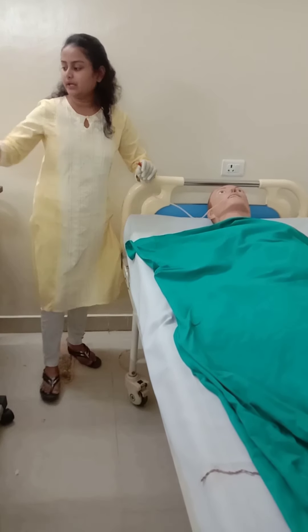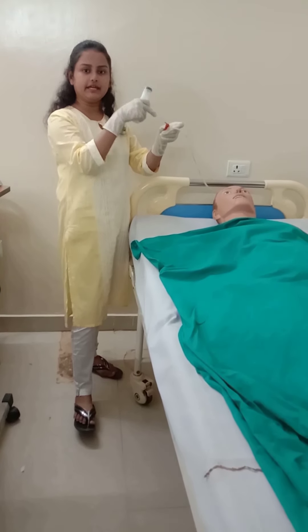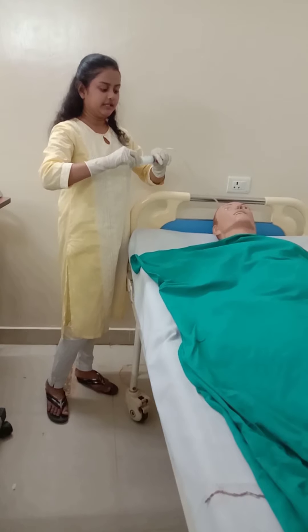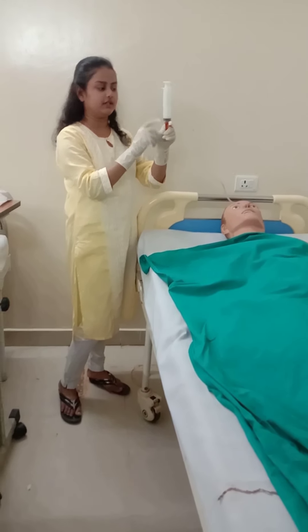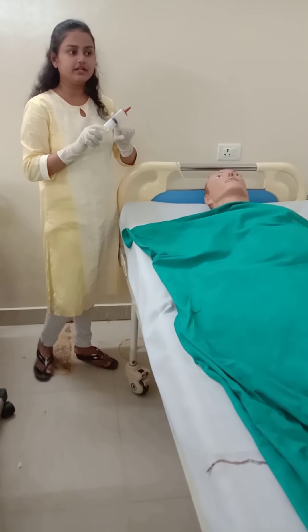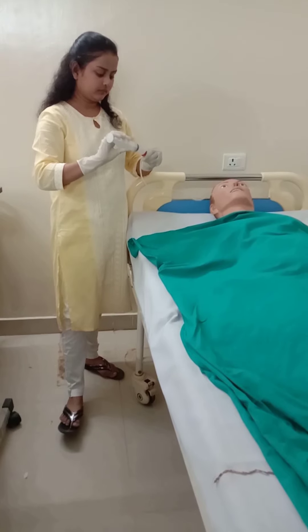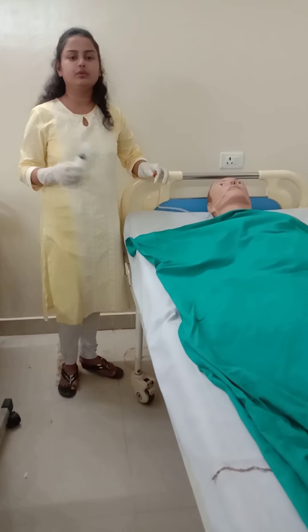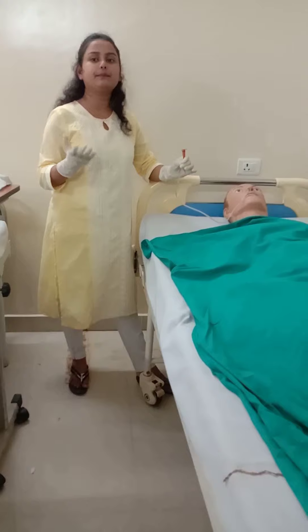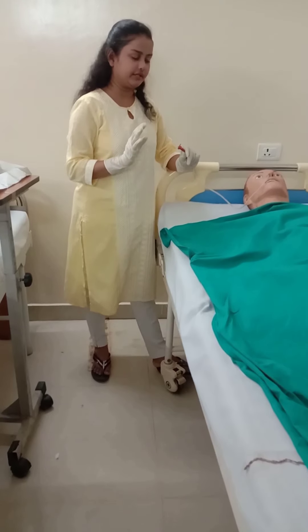For the aspiration technique, take a 50 ml syringe and clamp the Ryle's tube to prevent air entry. Attach the syringe into the funnel end, then aspirate. If gastric content is coming back and is visible, the Ryle's tube is correctly placed in the stomach; otherwise it is in the trachea. Additionally, the Ryle's tube has a radio-opaque line visible on X-ray, which can be used to confirm whether the tube is in the trachea or the stomach.